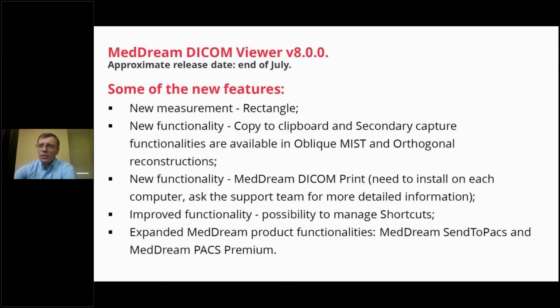Another thing, of course, for people who have been with Softneta for a long time: you always know that we always had SendToPACS, we always had Video Station and PACS Premium, but they were separate products in the past. Nowadays, we united all of them under one umbrella, MedDream, and now they are one product.